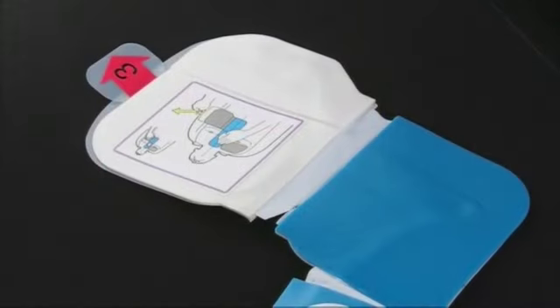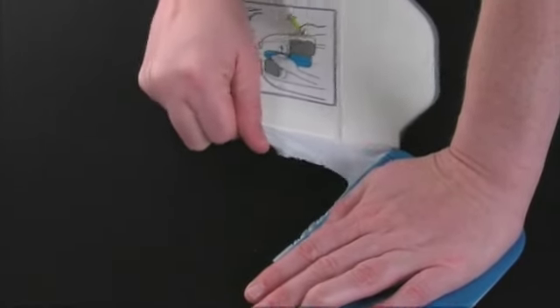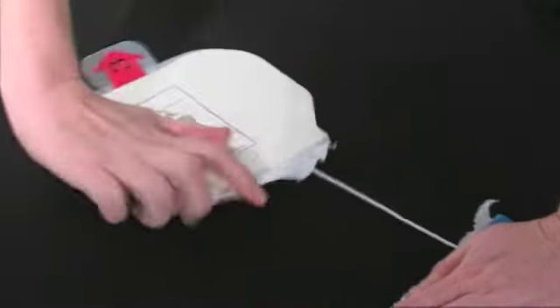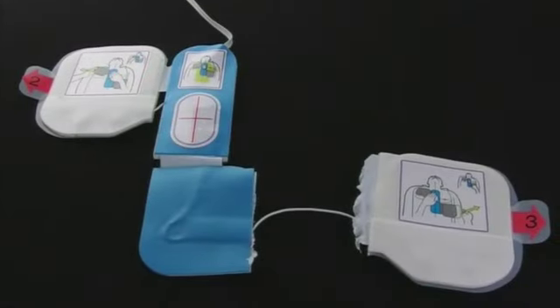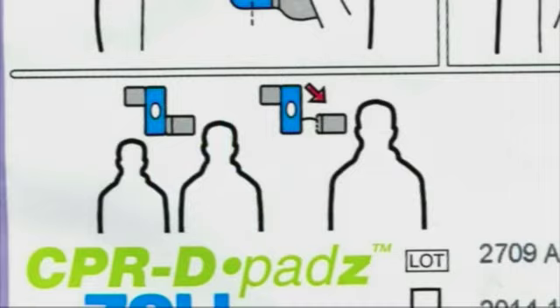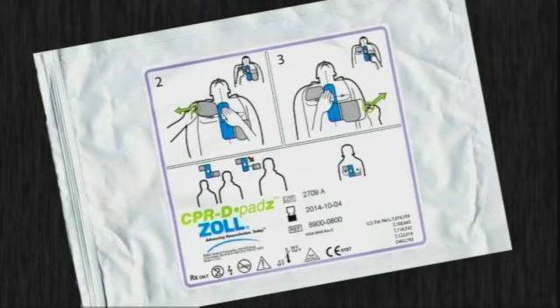If the patient is large, you will need to tear away the lower pad at the perforated line and extend it before pulling the number 3 tab. The pad should be placed on the side chest wall in line with the left armpit. Instructions on the electrode pack remind you how to attach the electrodes to the patient.